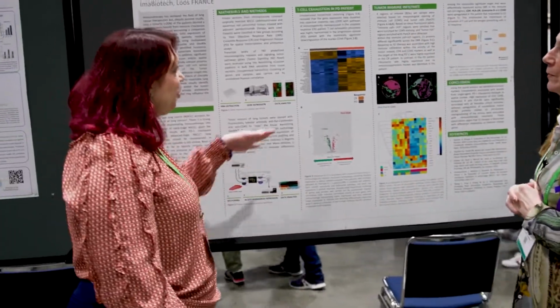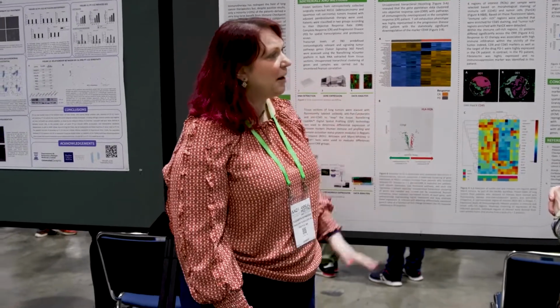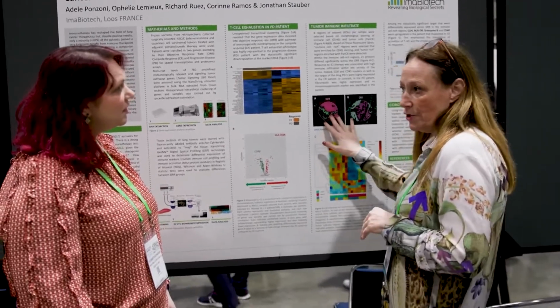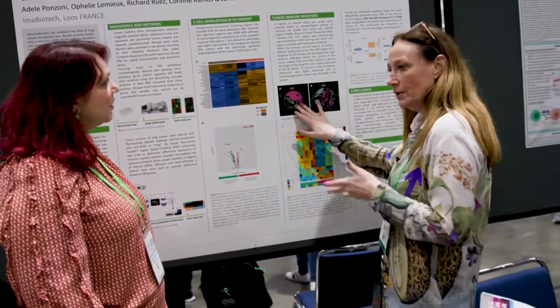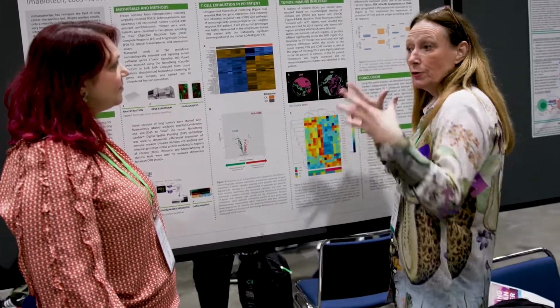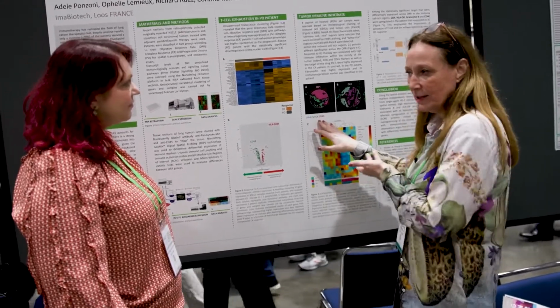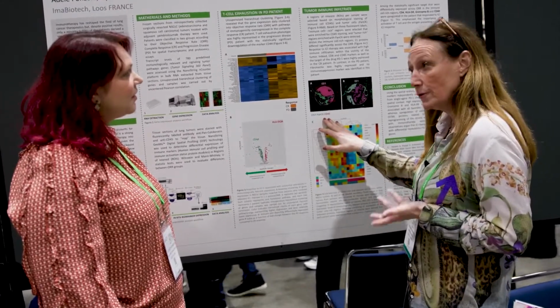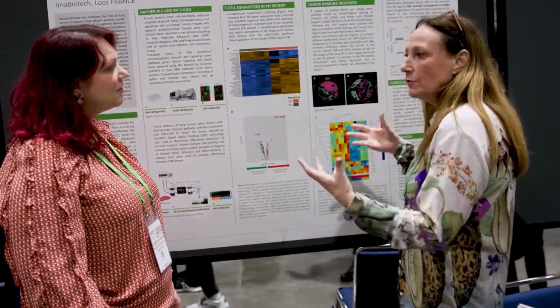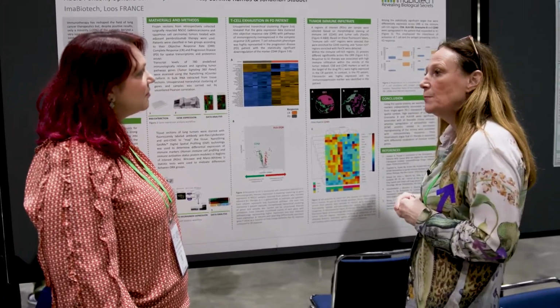I see. And with the GeoMx experiment, did you segment out the tumor versus the tumor microenvironment? This is exactly what we have done. We used the automatic segmentation algorithm from NanoString on the GeoMx, where we could automatically segment the tumor compartment versus the stroma compartment by using fluorescent antibodies, PanCK in that case, and CD45 for the stroma compartment. That's what we have done here, but sometimes we go a little bit further and try to segment only a very specific cell population.